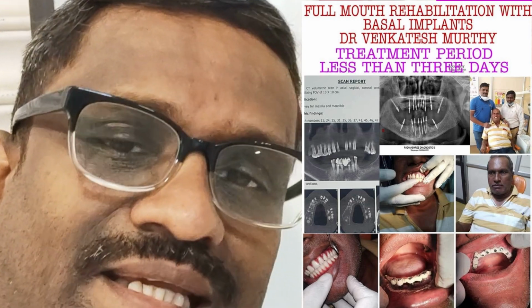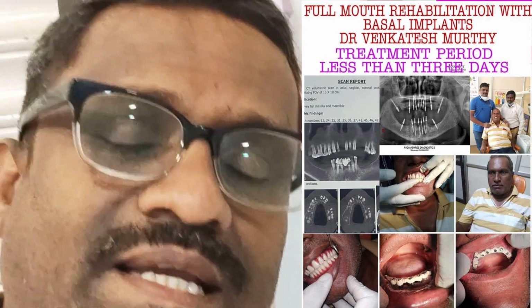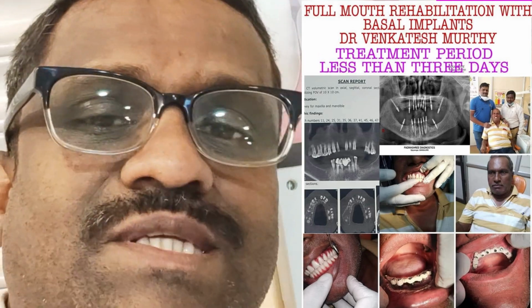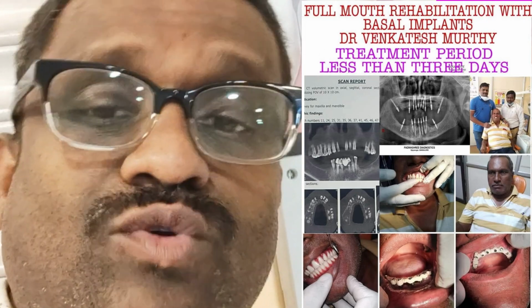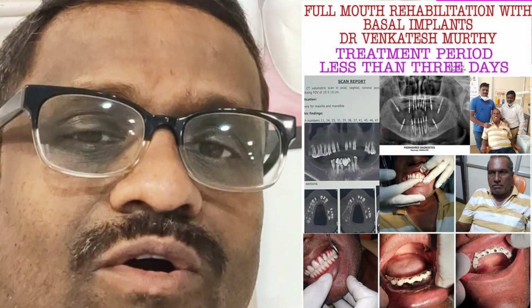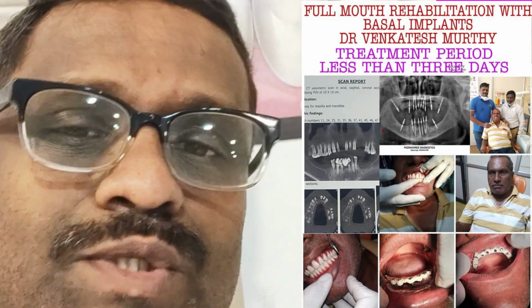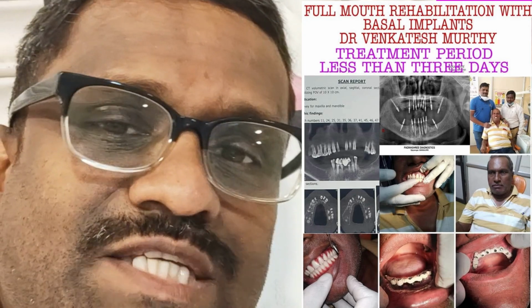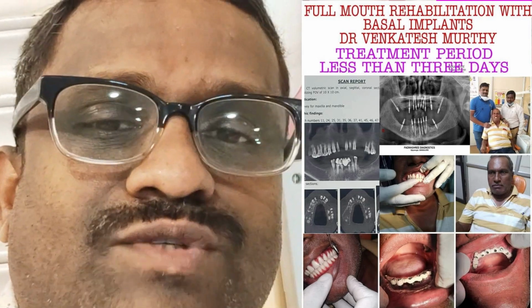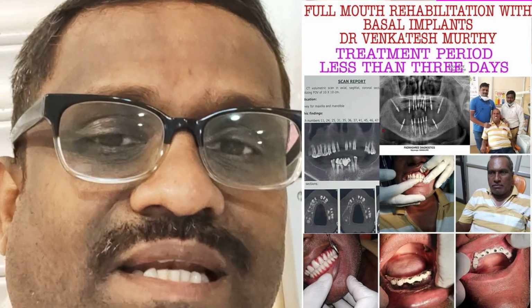In the anterior wall, that is the premolar and canine region, you can bypass, that is the canine bypass you can do, or through the premolar pointing towards the midline you can place lengthy implants, so it will engage well. In the posterior area, there are pterygoid implants you can place, double pterygoid you can place, or you can place tuberopterygoid implants that engage well in the pterygoid as well as in the tuberosity area. So in that way you can avoid placing the implant in the maxillary molars.